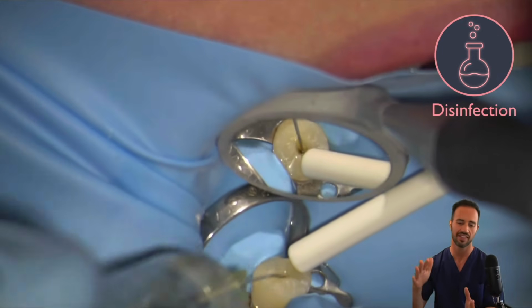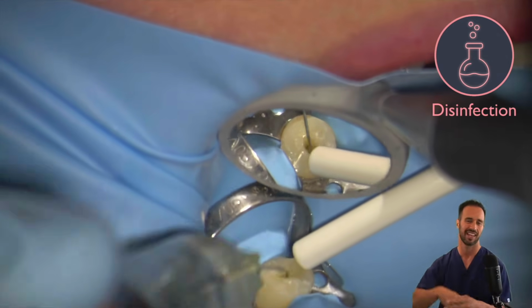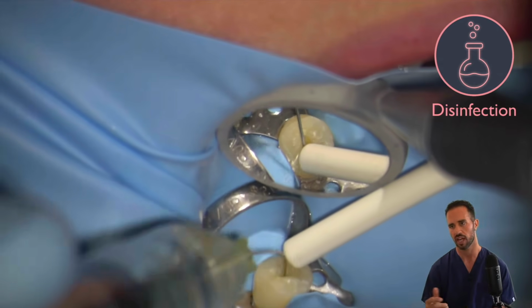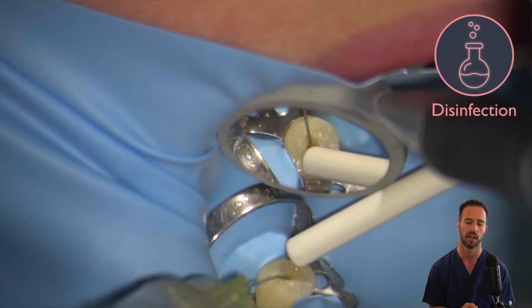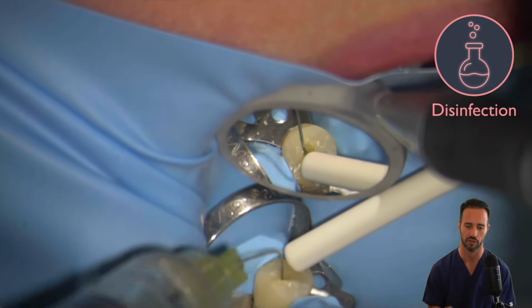So this is now the disinfection stage of our case, where we're going to pass a lot of sodium hypochlorite through the tooth. Okay, don't be shy about passing, like I mentioned, between 10 and 20 milliliters of sodium hypochlorite through a case. I would encourage you to do that, especially for necrotic cases.